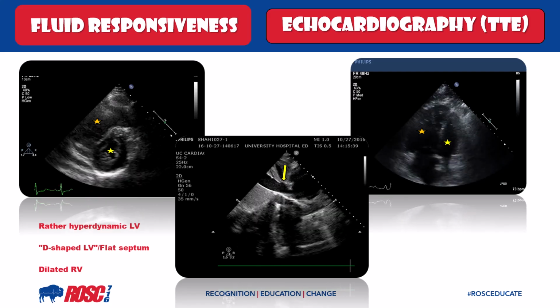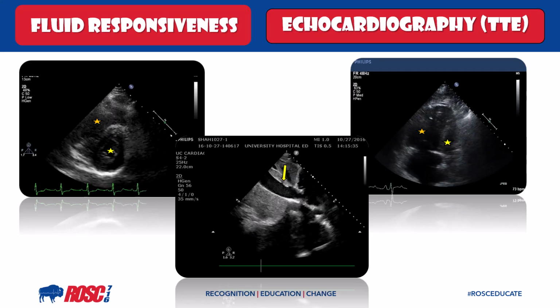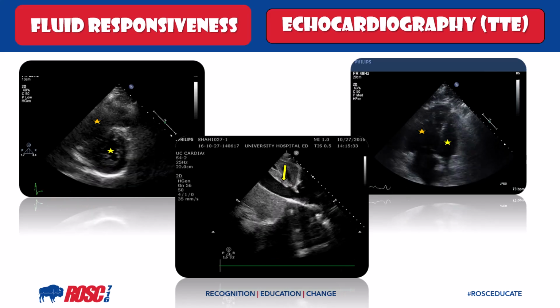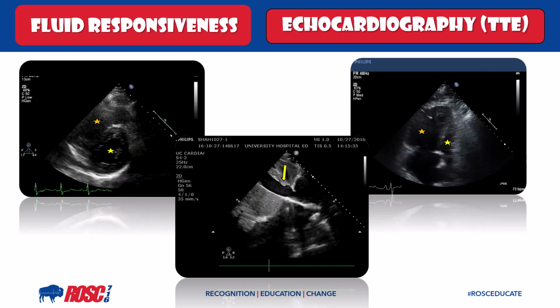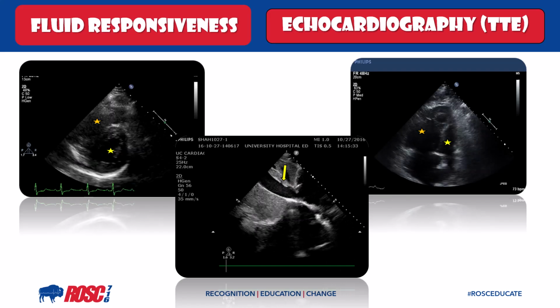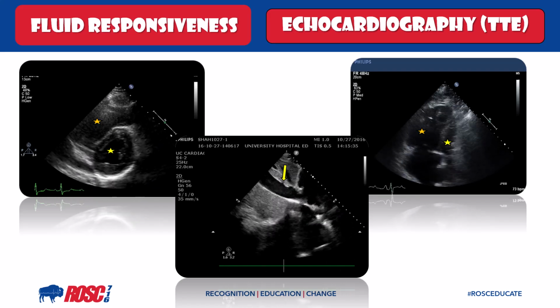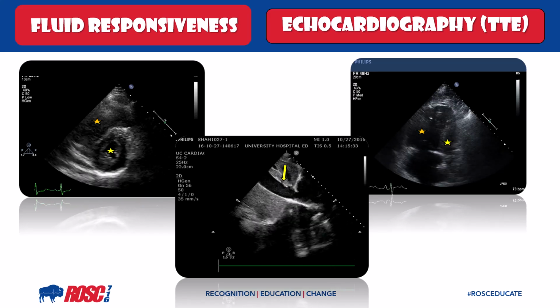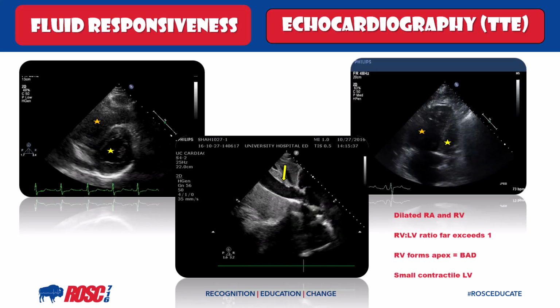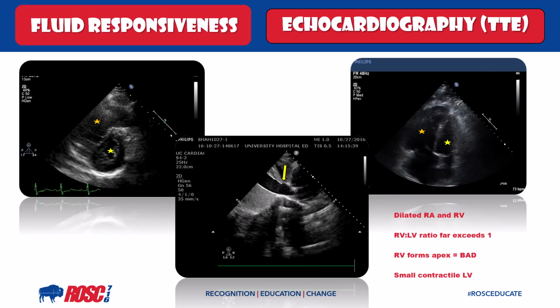How does this clinically relate? This affects the right to left blood flow and also the ejection of the left ventricle because of the compression, not able to eject. So i.e. this drops the left ventricular stroke volume. We take a look over the image to the right, which is the four-chamber. The yellow star is the LV. The orange star is the RV. The RV should never be bigger than the LV. The apex in this window is formed by the RV. That is also a bad thing.